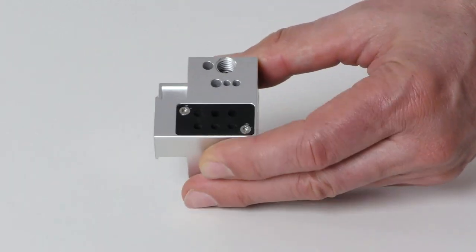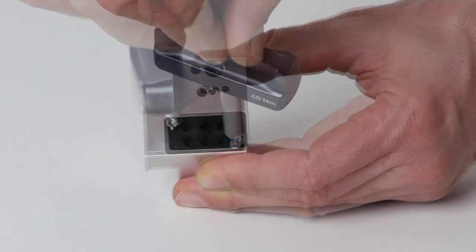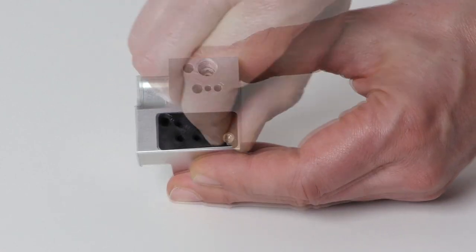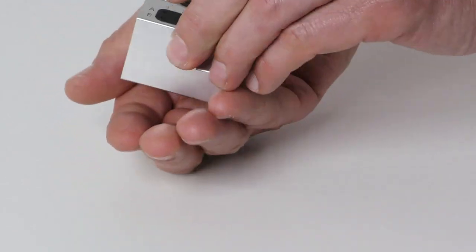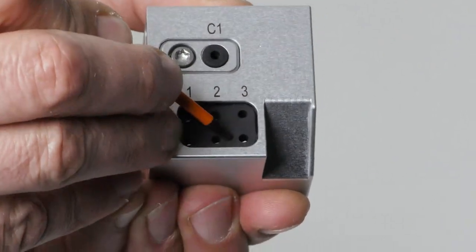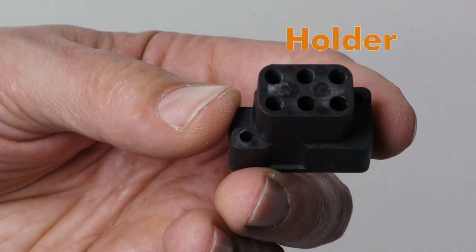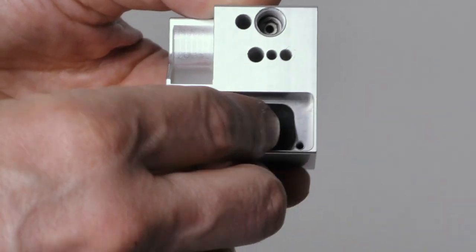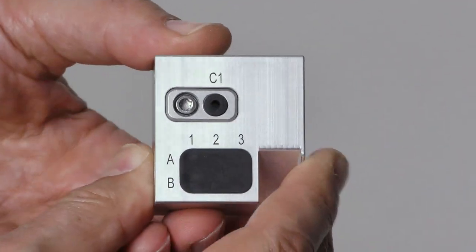Unscrew the two screws of the tool magazine insert holder on the underside of the tool magazine. Let the tool magazine insert holder and the screws slide into your hands. Press the tool magazine insert down out of the opening. Get the required spare parts. Insert the tool magazine insert from below into the opening. Make sure that the top of the tool magazine insert is flush with the surface of the tool magazine.